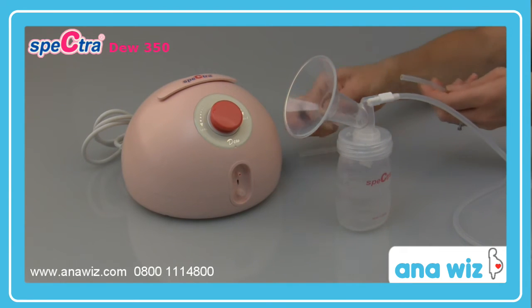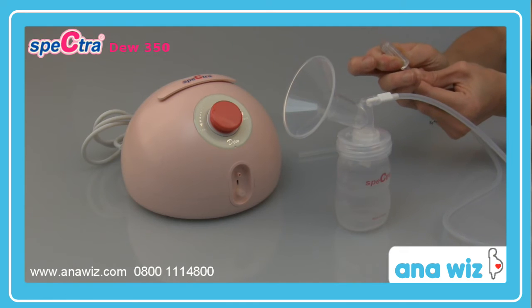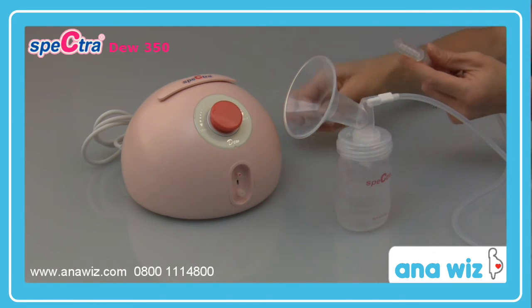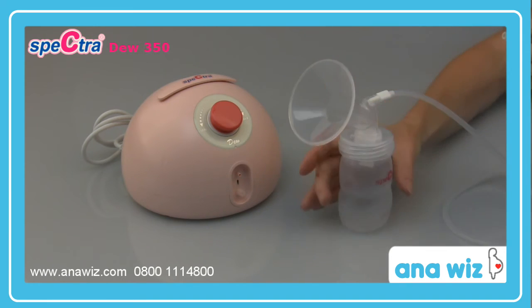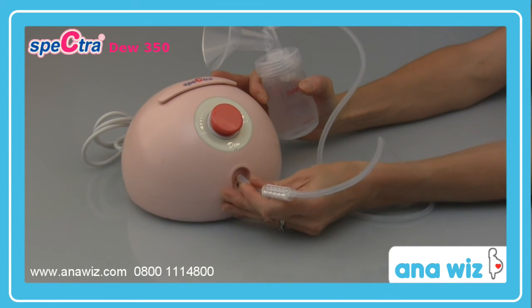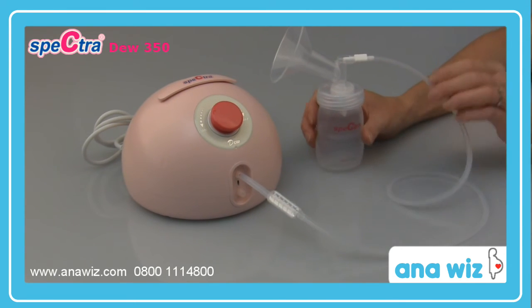and then attach the tubing to one side of the backflow prevention filter, and then attach the shorter tube to the other side, and finally attach it to the main body of the unit.